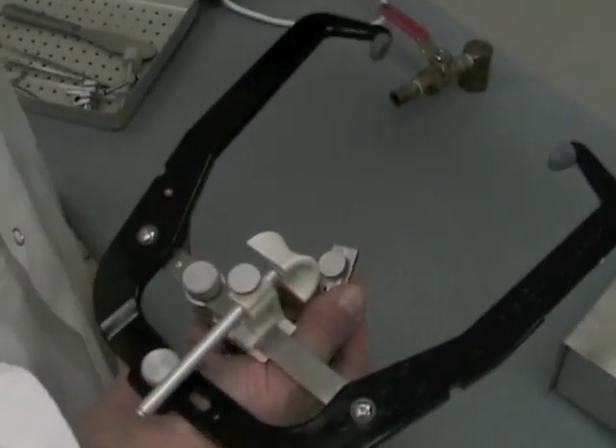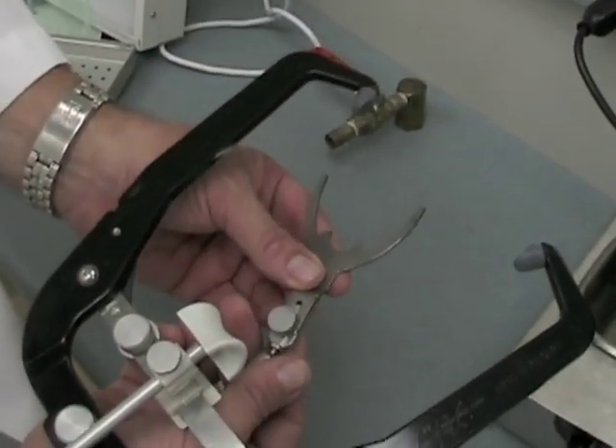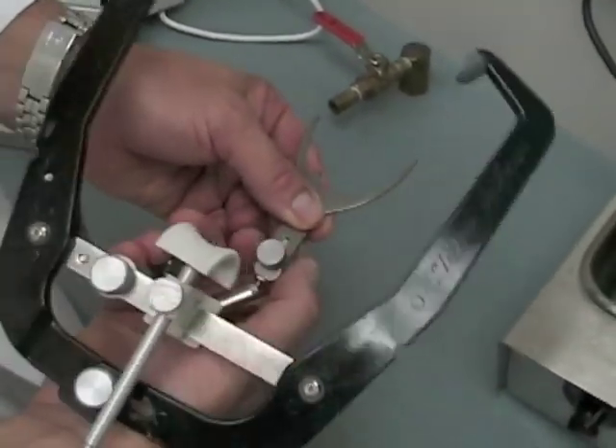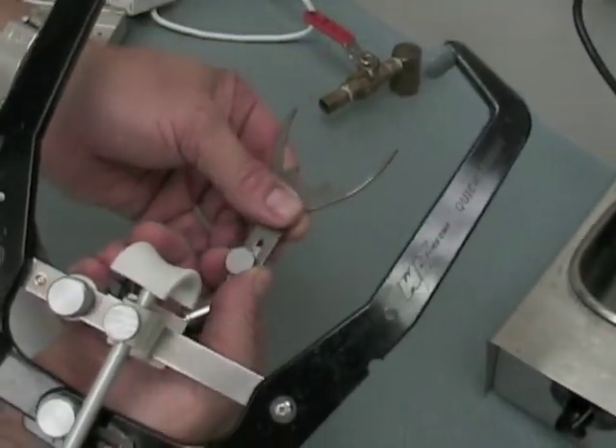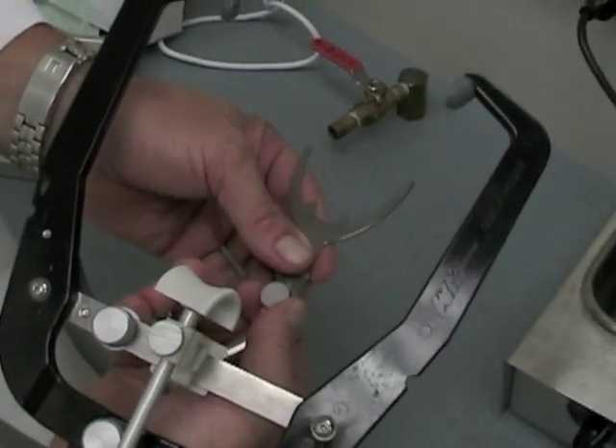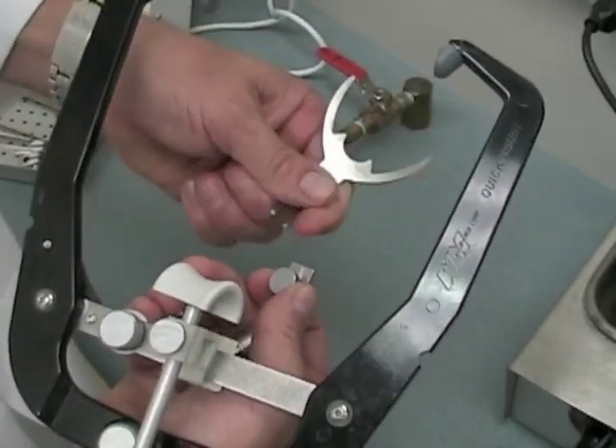For edentulous patients, use the edentulous bite fork. It can be inserted in the slot on the quick lock toggle assembly and then tightened into place. It doesn't really matter which way you rotate it — it can go one way or the other, whichever is more convenient for the particular patient.